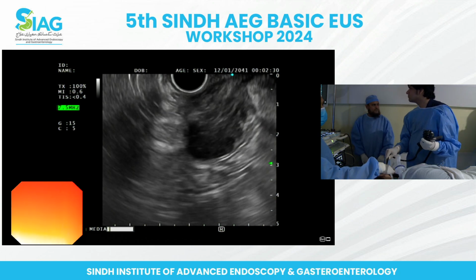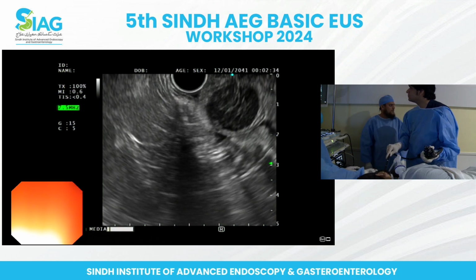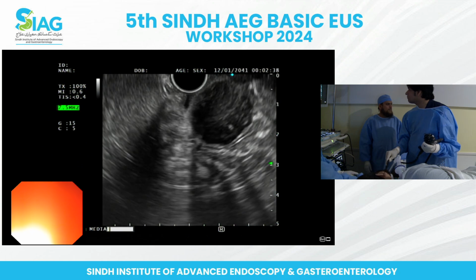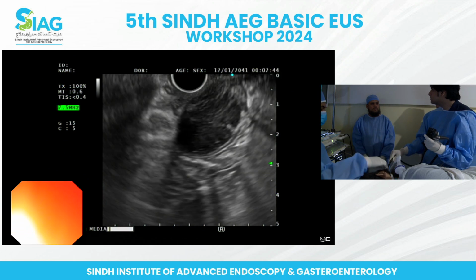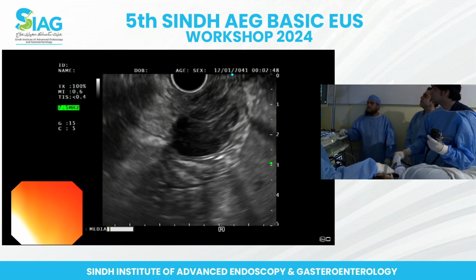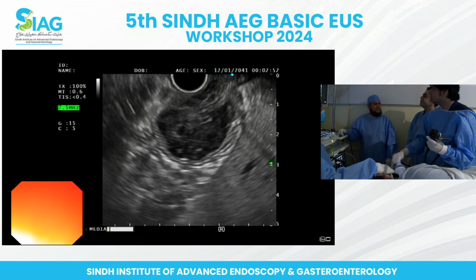How are we doing with the? Okay. ये क्या वो material tissue लग रहा है या वो लग रहा है? Tissue लग रहा है. Okay. Heterogeneous. Yeah. So Khalid bhai, we've got some samples. We'll just do one more pass. If you want to make your way for the liver segments, if you come to our room.